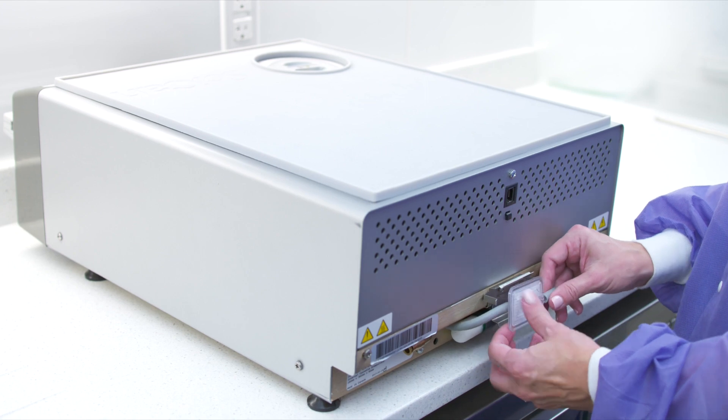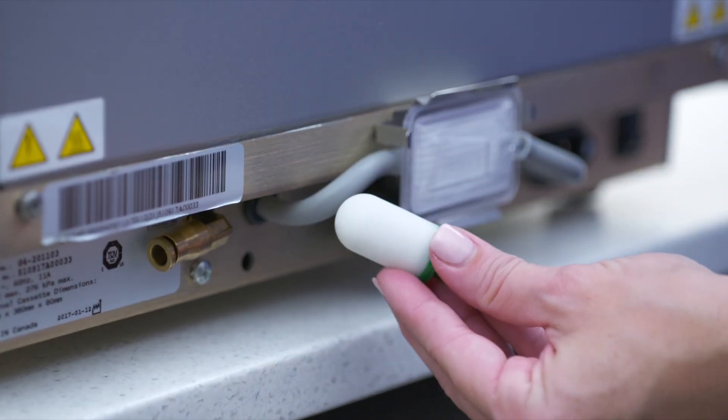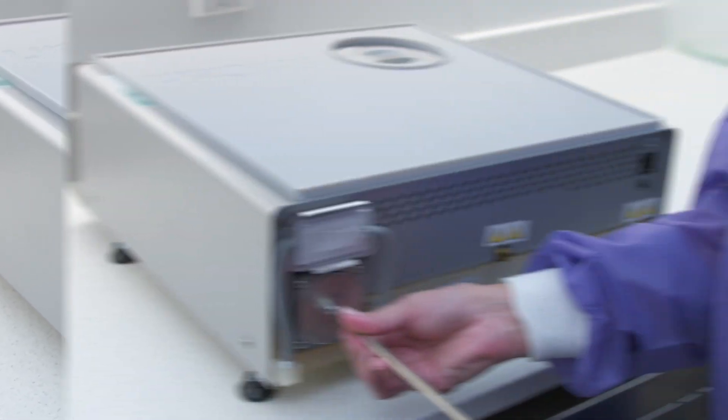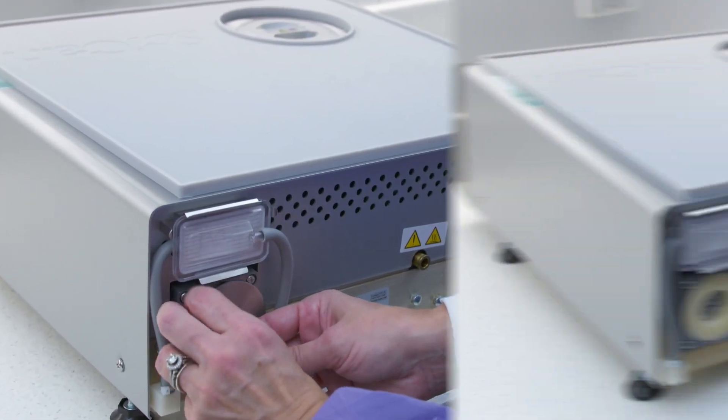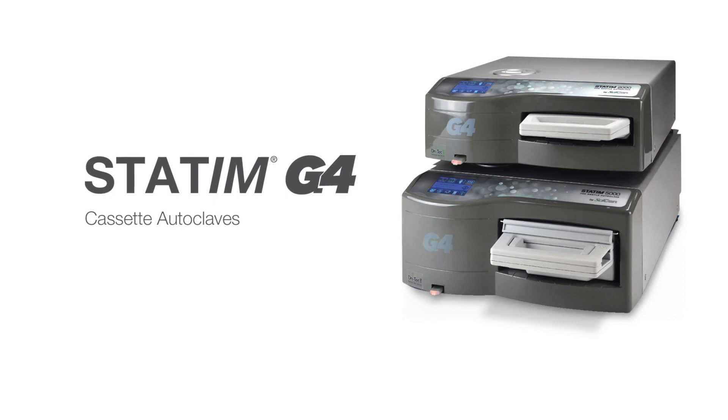When changing the seal, always replace the filters found at the back of the unit at the same time. Additional details of installing, operating, and maintaining your STATUM are all contained within the Operator's Manual. Please read these instructions before operating this unit and keep them for future reference. Thank you again for making SCICAN your choice.